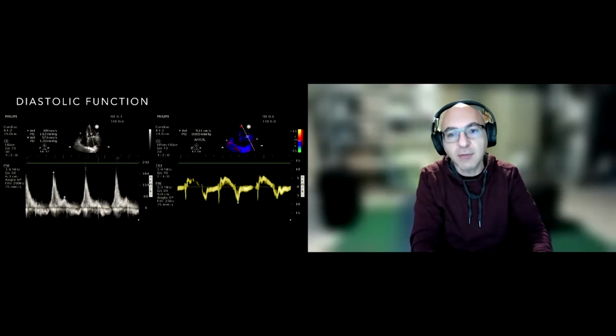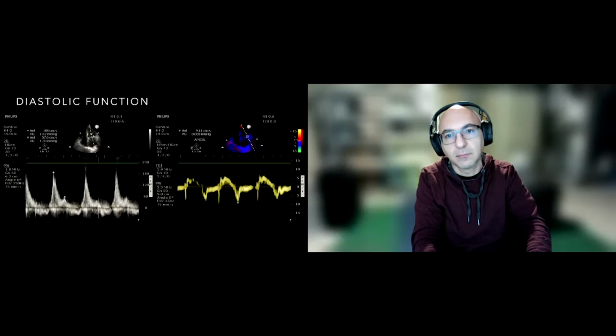So look at the left atrial pressure or an estimate of the wedge pressure, and that will give you an answer. And you might not get an answer. You might do the measurements and still be in the middle zone and not know. So in which situation would you just say, we're going to try positive pressure, like CPAP, as opposed to diuresis, and see if the patient improves just with CPAP alone or BiPAP?